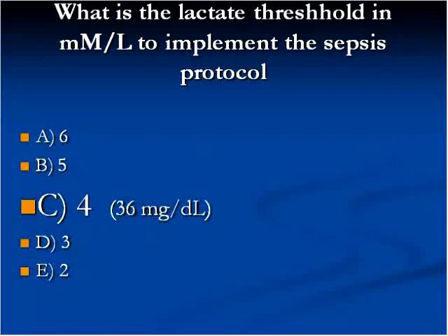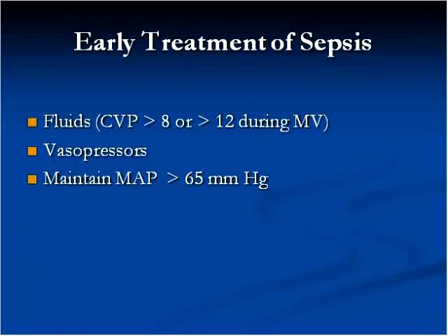And indeed, they say when the lactate, which is normally less than 2 or nearly 2, and that, by the way, those units are millimoles per liter. That's how it's usually recorded. Some places will use milligrams per deciliter, and that gives you a much higher number, almost 10 times as high.